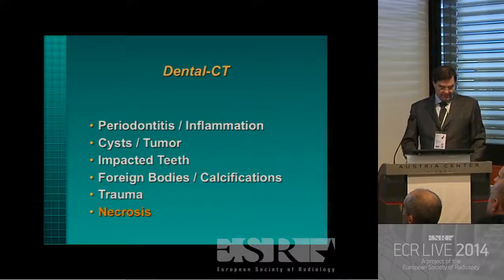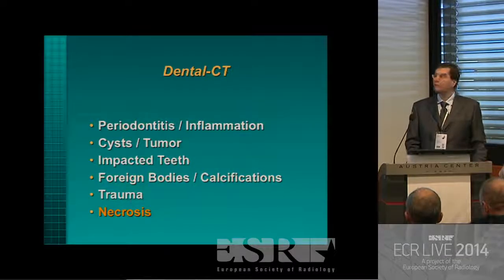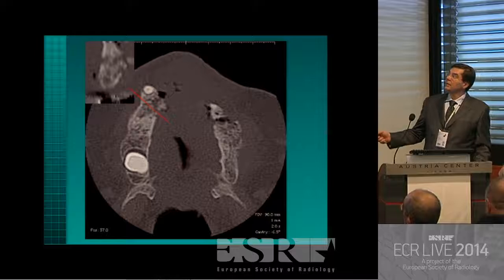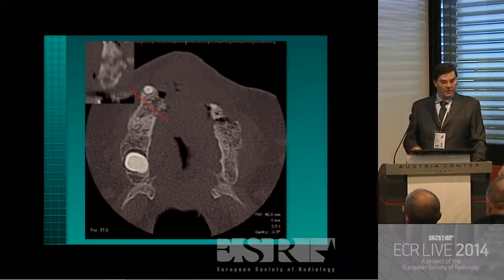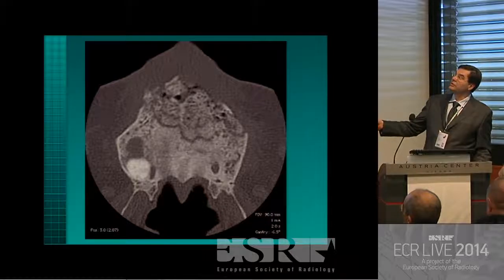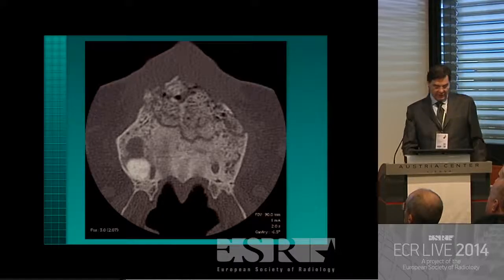And one thing which I wanted to add is necrosis, which is becoming more and more of a problem in the last years when you get bisphosphonate therapy after carcinoma, mamma carcinoma. We see more and more patients developing necrosis of the jaw region. And this can be not only a small problem, it can be also a large problem where nearly 1/3 of the jaw gets necrotic and is sequestrated. You see the sequestration line here in the front.